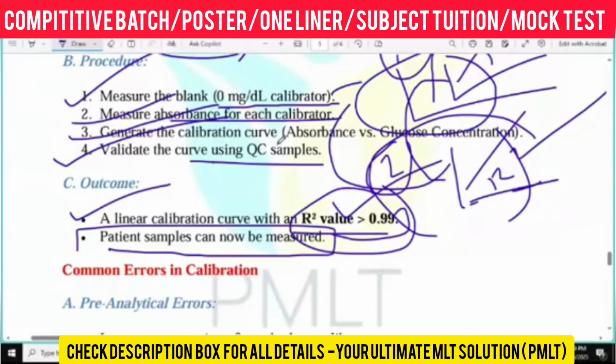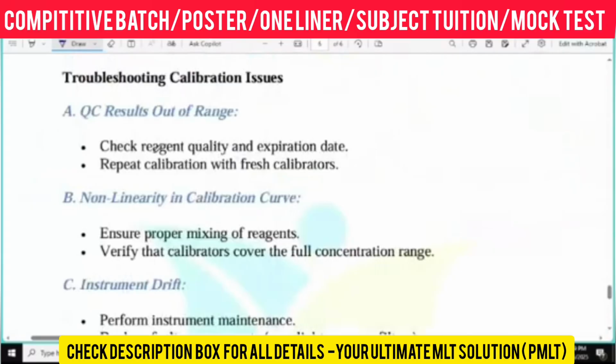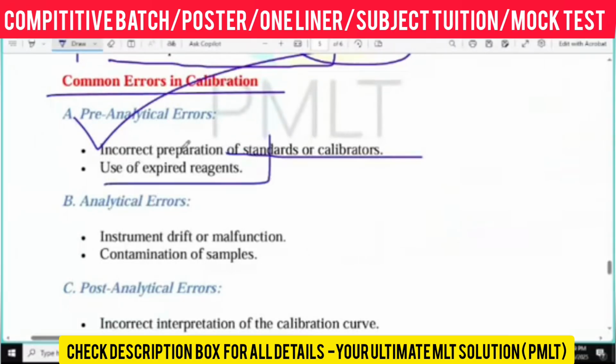I think no. See, the common errors here are also of the same kinds. Pre-analytical errors: incorrect standard or calibrator, or using expired reagent. Getting my point?